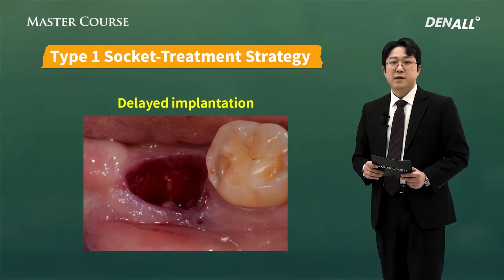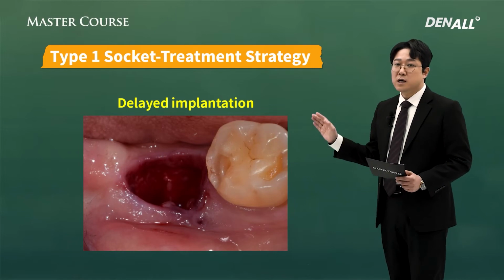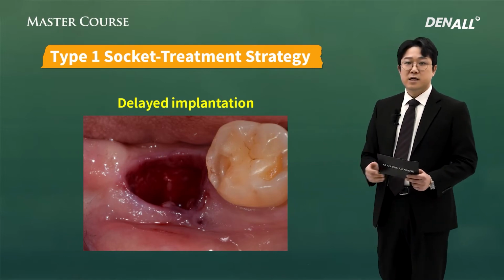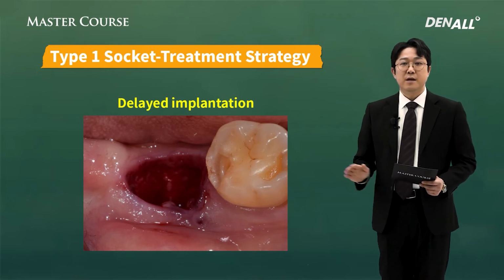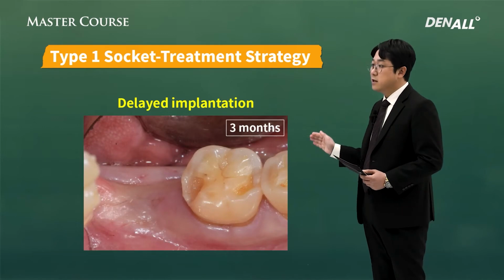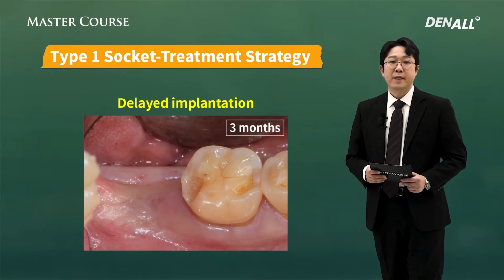Extraction was done. The extraction socket had no damage, and it was a sound socket, so I didn't do anything else and just waited. This is after 3 months. Soft tissue healing is very nicely done.